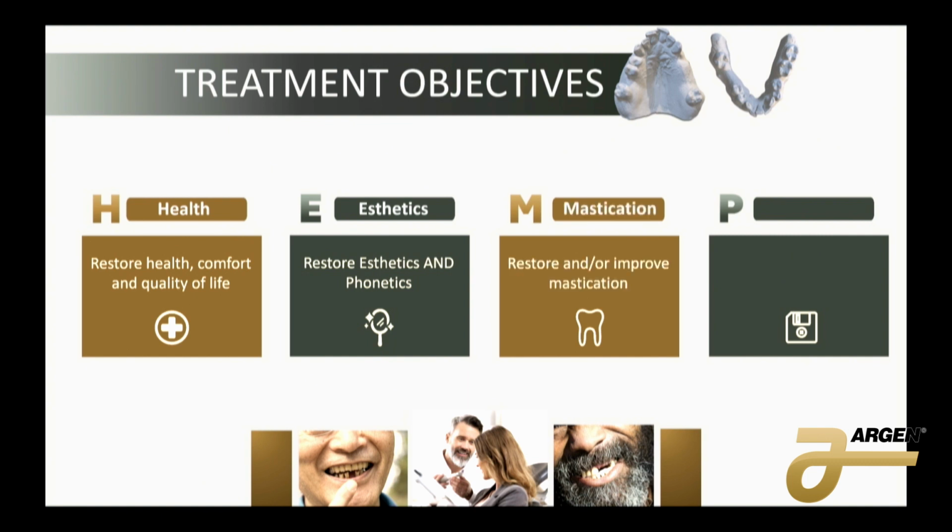Phonetics is very important. We are restoring and improving mastication. They have to be able to chew and eat with this in their mouth. This isn't just to look pretty. This needs to be functional. And the most important one is preservation.